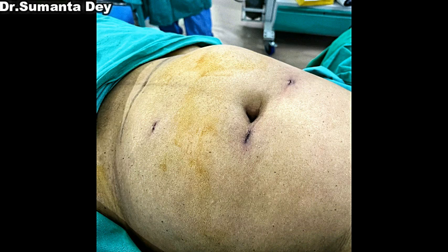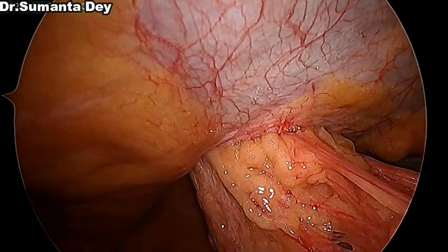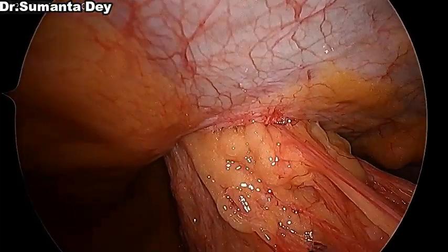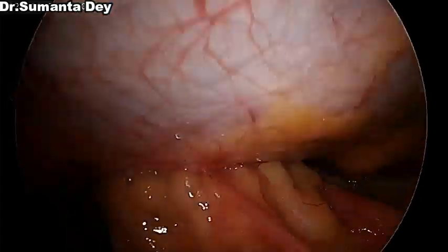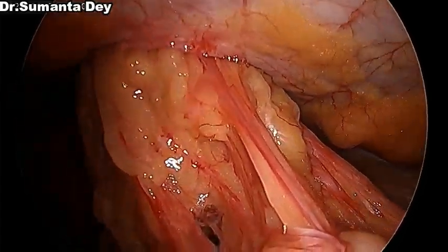So these are my port positions: just left paraumbilical camera port, 10 millimeter, and the rest of the two ports are right and left working ports, maintaining the triangulation, and you can see the TAH scar. So the patient had a total abdominal hysterectomy, I think 10 years back, following which she gradually developed a swelling over the right iliac fossa, and now there is a big hernia.